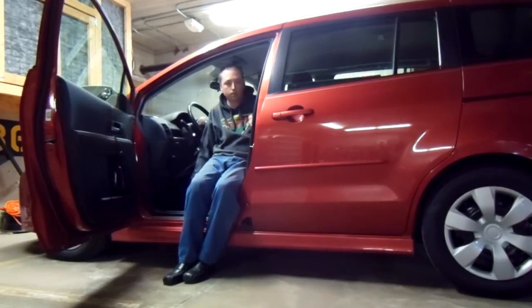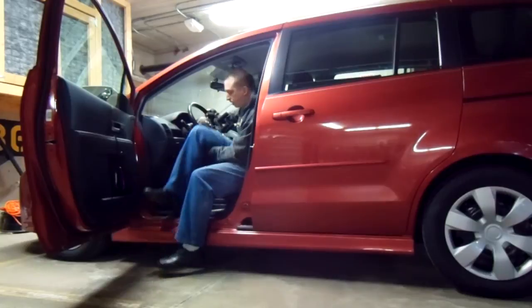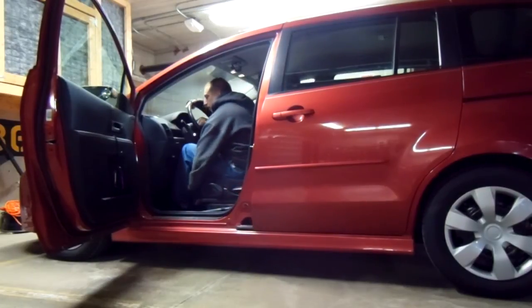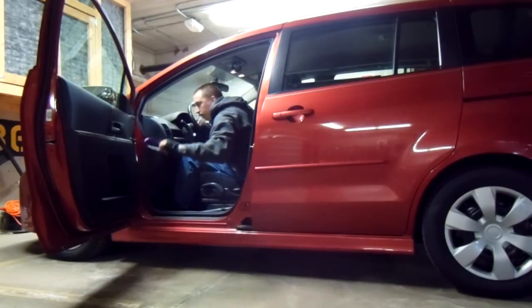I slide my seat back the rest of the way so I have room to get my legs under the hand controls. Then closing the door, I put this rope and carabiner on the handle, which makes it a little easier.